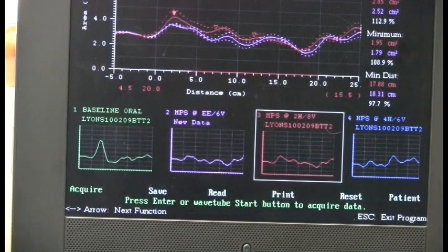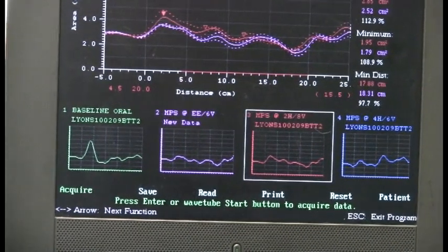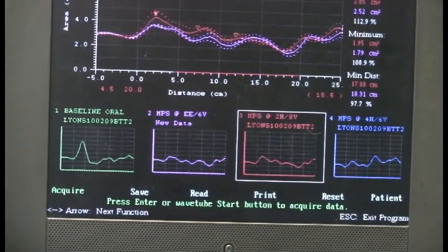Now we're going to try a 2/8. Here we go again. First notch on the top, 2 is facing you. We're in the third scan position. And here we go.